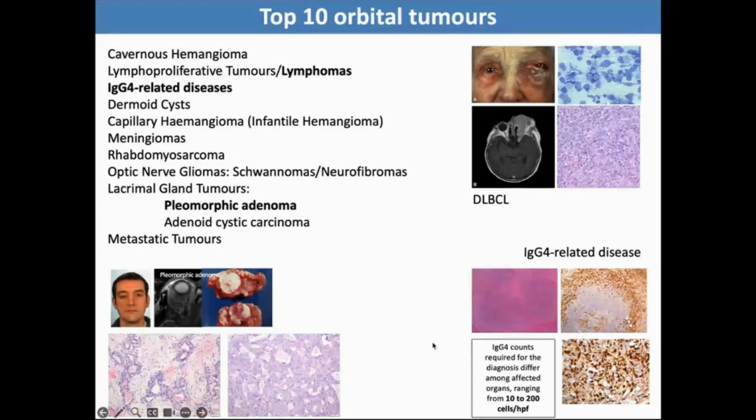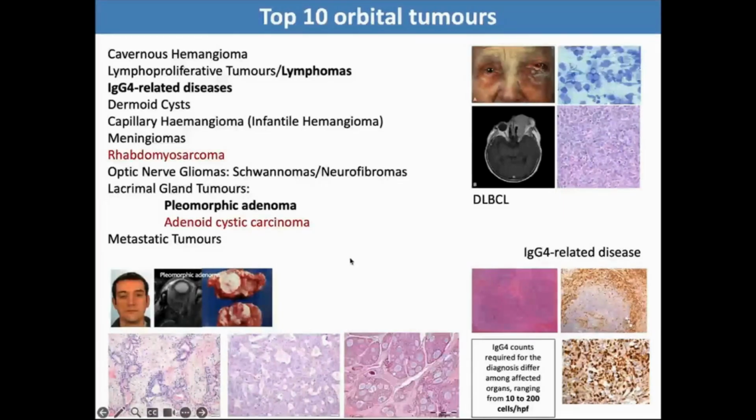into a lymphoma. So another condition which is malignant, which arises from the lacrimal gland, is adenoid cystic carcinoma, which has typically this Swiss cheese-like appearance and can vary in its degree of differentiation. It's a deadly tumor. It spreads, shows typical perineural and intraneural extension, and unfortunately the patients have poor prognosis.